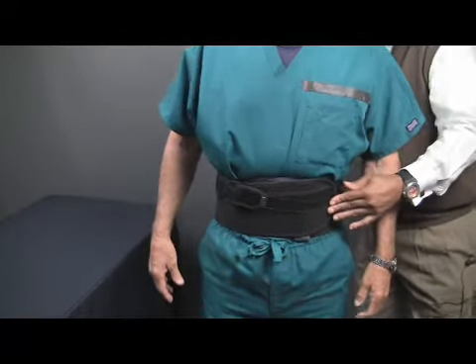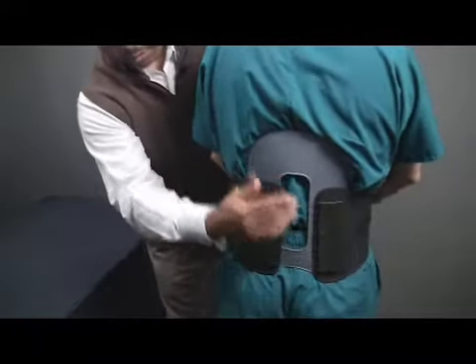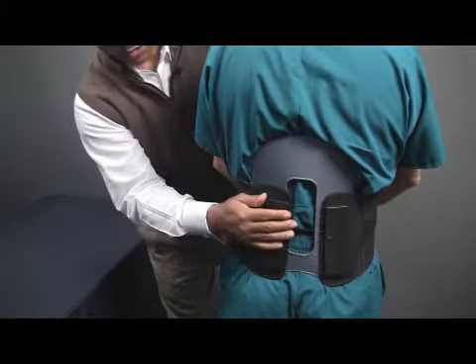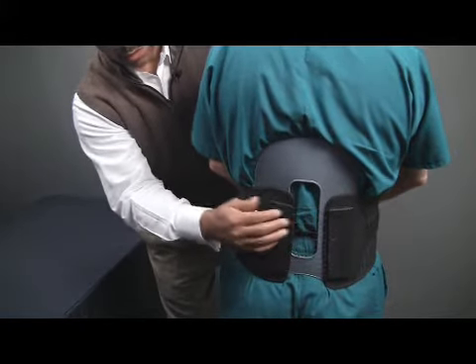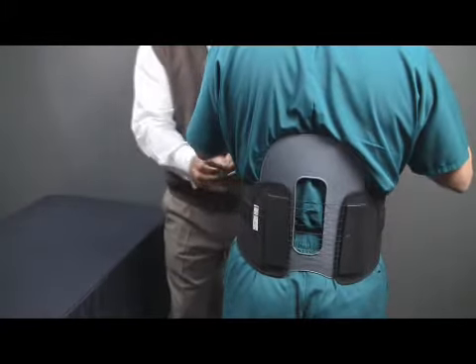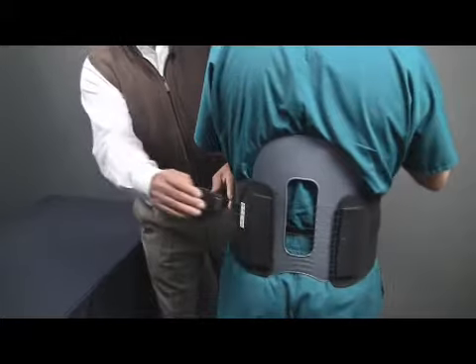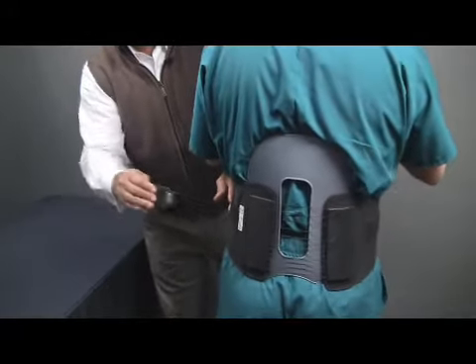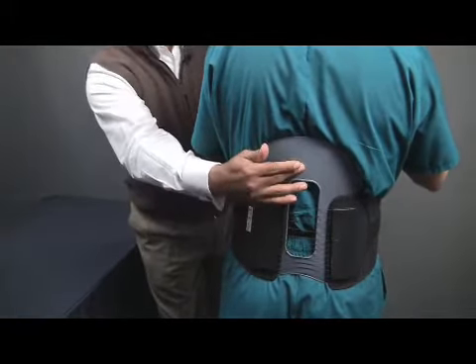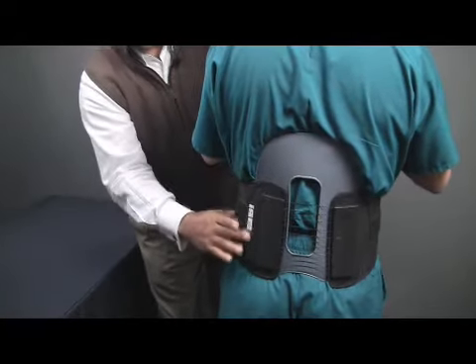Posterior panel — please turn. And you're still able to have an open area for healing of the sutures. So a laminectomy discectomy, multilevel fusions, whatever procedure has taken place, you're able again to utilize a Cybertek system to provide support and still have the modularity of the brace. Anterior panel and posterior panel are removable and you have a maintenance brace.